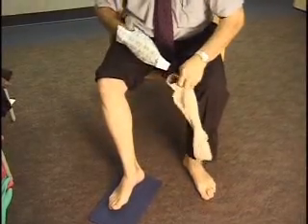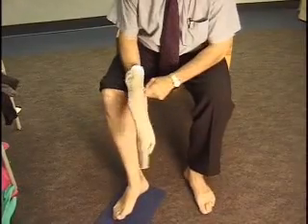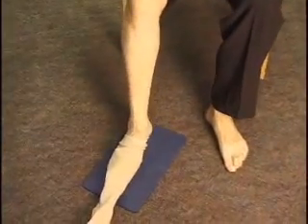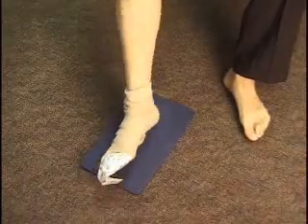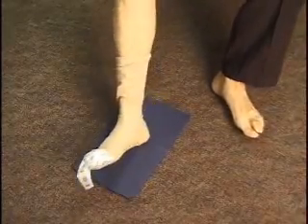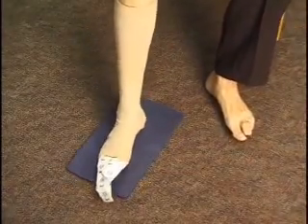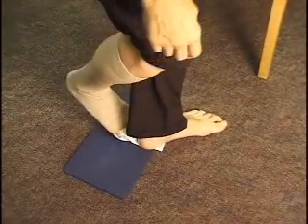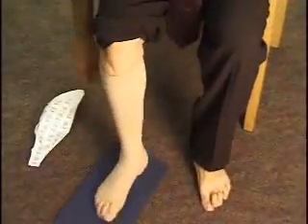Here we see another slipper made of the common material used to wrap houses for insulation. The method of application is the same. It is important to make sure that part of the slipper gets over the heel to facilitate the stocking going over this heel. Again, one can adjust the heel by pressure on the rubber pad with a foot. This slipper, which is made of slippery material, is easily removed, which is the real advantage of this material. Final adjustments in the stocking fit can be made using the rubber pad.